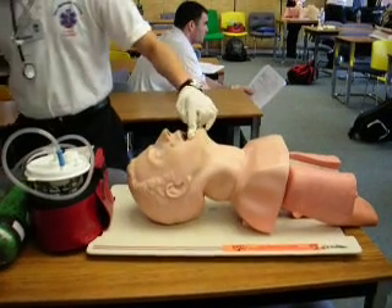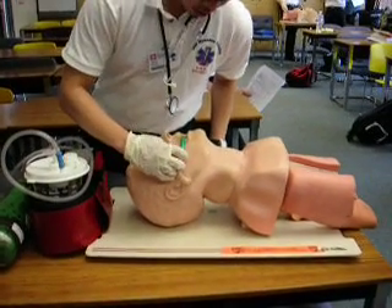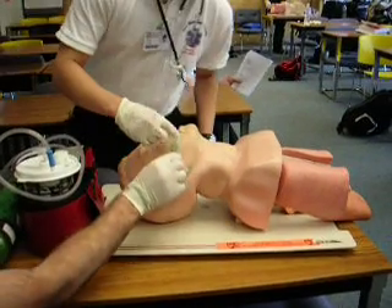For the oral — the OPA — you measure from the mouth to the earlobe. This one's a little too long, but I think this one was good.